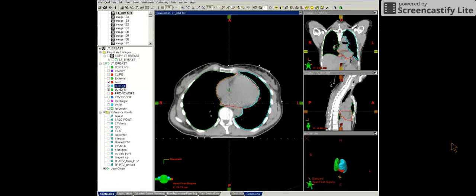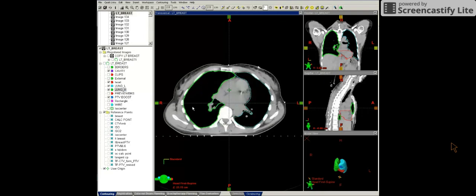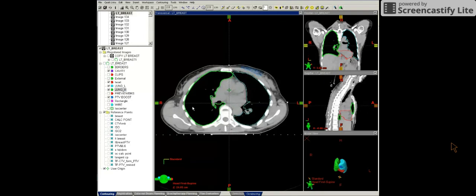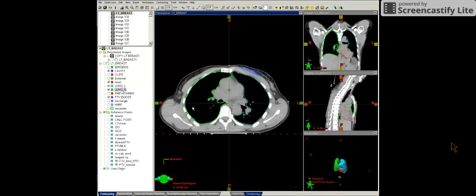So contours that we use for 3D breast planning is the heart, the lungs, cavity, and the PTV boost. And this concludes the contours needed for 3D breast planning.